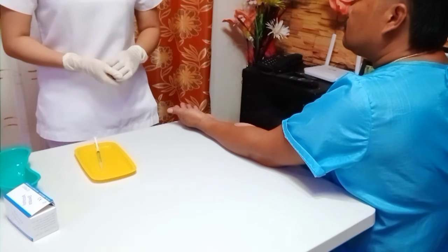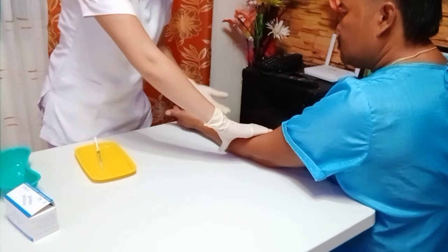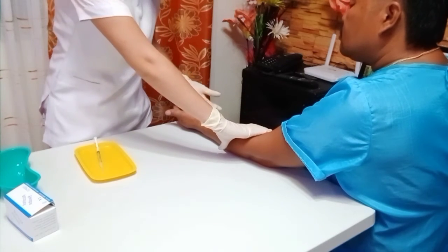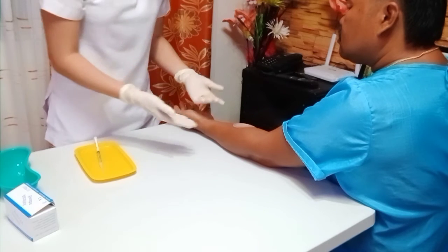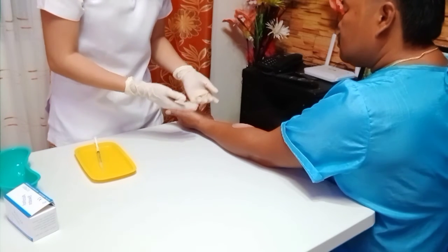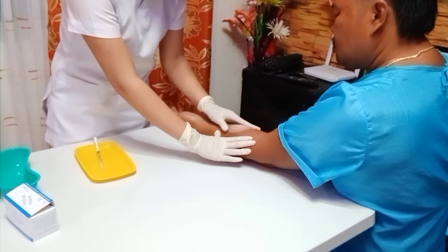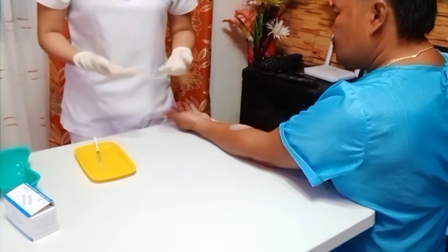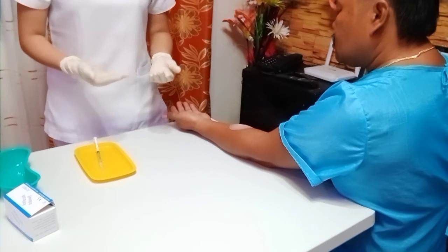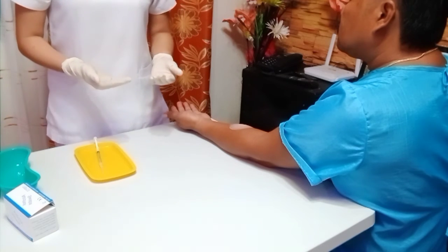Next is to select a site. But for this return demonstration video, I will not be able to inject the medication directly into the client's skin without the supervision of a registered nurse. So instead, I will be using a synthetic skin. Good visualization is necessary to establish the correct location so as to prevent damage to the tissues.